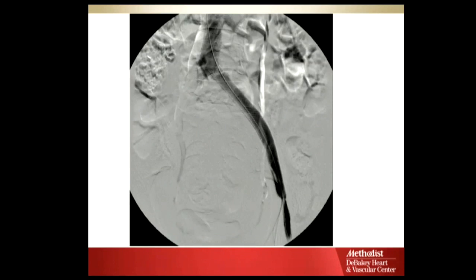So again, you can see a filter, with a vein occlusion. Now remember, a lot of times you don't know right or left because some people do these procedures prone, which means patient facing down, so things might get flipped. So just keep that in mind. But that's the iliac artery impingement. It's dilated and flat. Typically we use a Wallstent to treat May-Thurner.